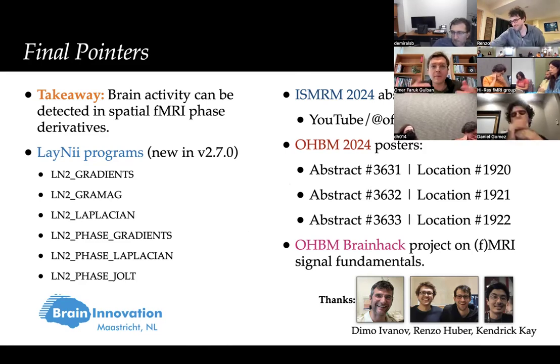And actually my point was that if we were to look for what they are suggesting, we would need a very low echo time fMRI protocol to catch it. We cannot catch it with long echo time. We can only catch big vein oxygenation-based changes. That's my point, so we actually agree. Okay. Yeah. Okay. Good.